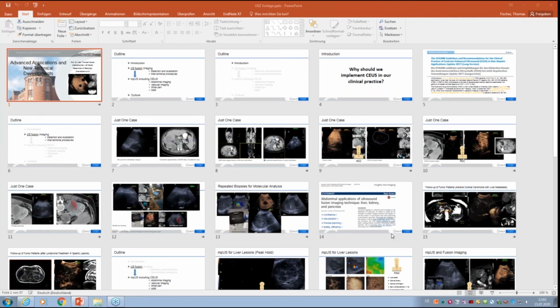And so ultrasound is an easy problem solver. If you get all these renal cystic lesions, there are so many lesions day by day. So I think ultrasound is the key message. Of course, also with better cost effectiveness. Yes, and we've seen this cost effective in the liver.